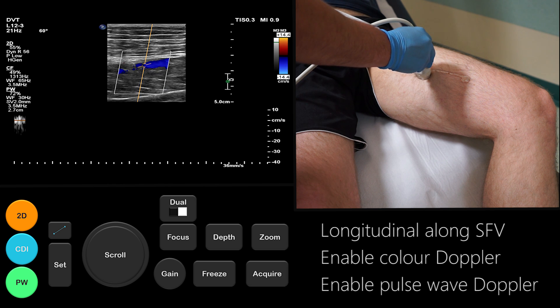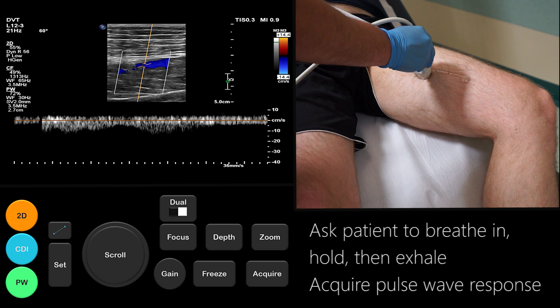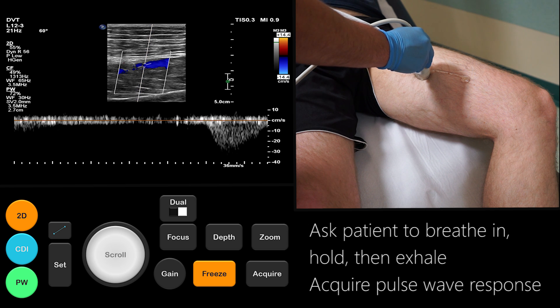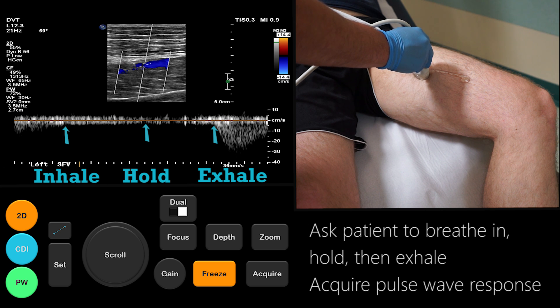Here is an example of normal venous flow. Normal venous blood flow should also show a response to the Valsalva manoeuvre. To demonstrate this, start the pulse wave Doppler and ask the patient to take a breath in, hold it, then exhale. A normal response here indicates patency of the iliac veins and proximal venous system.